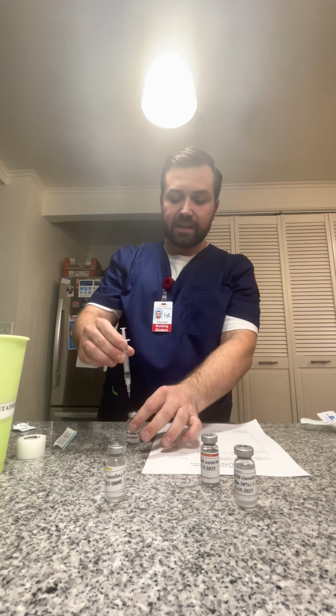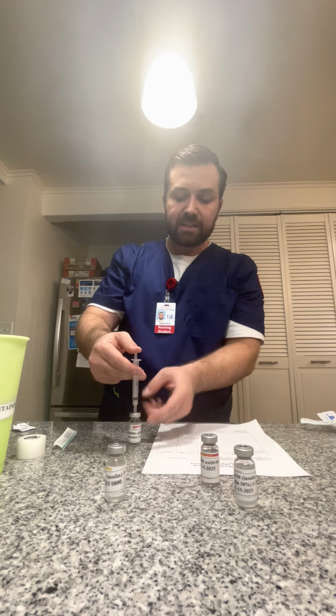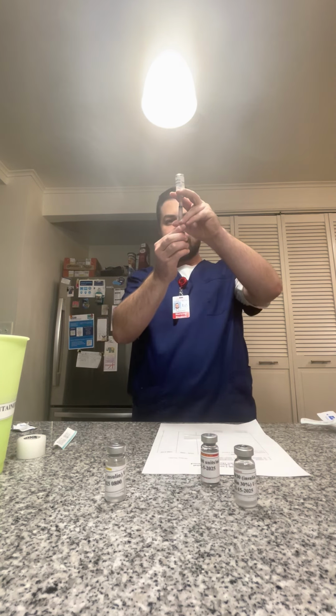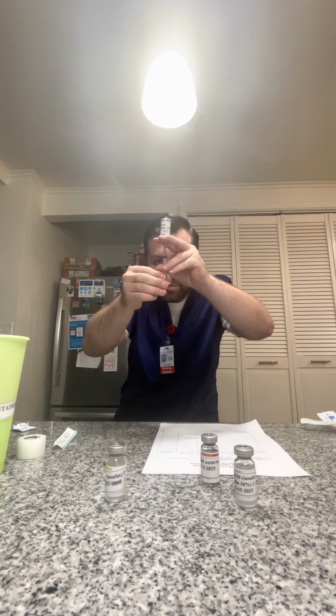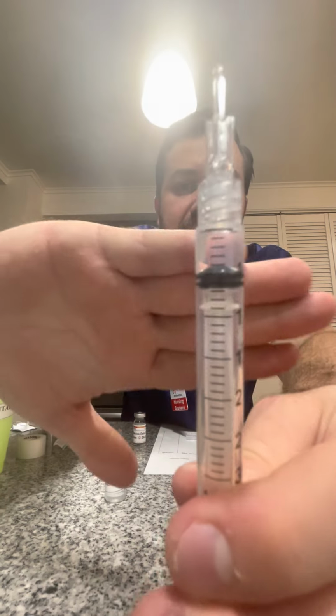All right, I'm going to take off my cap and place it here. I pulled up 0.5 milliliters per the dose, and I will be injecting the air into the vial, which I cleaned the top of with an alcohol wipe. If I pull back any air bubbles, you can tap, which I did to get them out. Perfect. So this is the right dose.